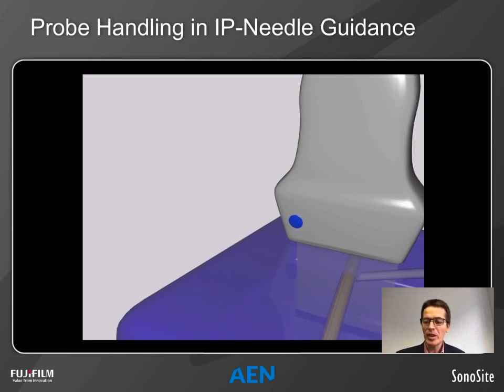And also in in-plane procedures, you may have a rotation error so that the needle path is not perfectly aligned with the scanning plane. And of course you then have to correct this error by probe rotation.